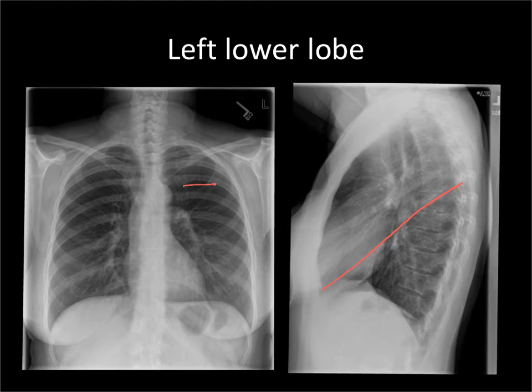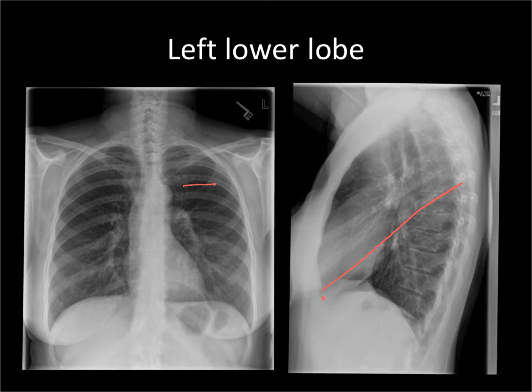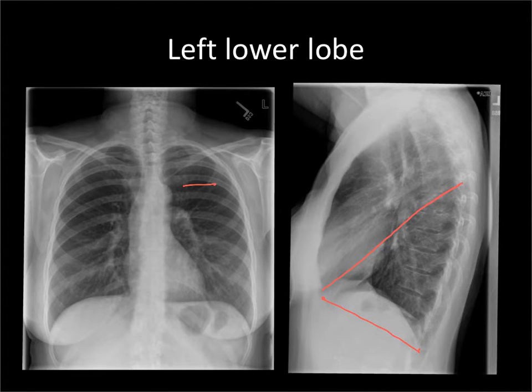The lower portion of the lung comes down well below the level of the domes of the hemidiaphragm. If you draw a line from the anterior costophrenic angle to the posterior costophrenic angle, that gives you some idea of how far the lungs come down. On the frontal radiograph, we're talking about the lungs coming down something like this.